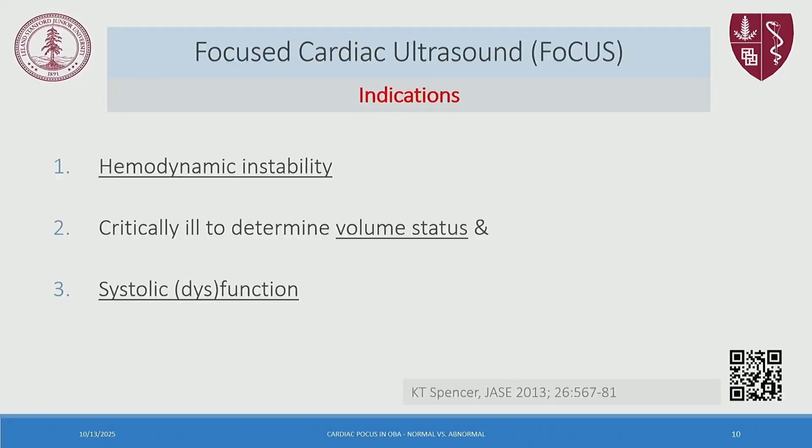So according to the American Society of Echocardiography, the appropriate terminology is focused cardiac ultrasound. And the defined indications are a patient that is hemodynamically unstable or a patient that is critically ill where you want to define the volume status and systolic function. And a focused cardiac ultrasound is always integrated into the clinical context.